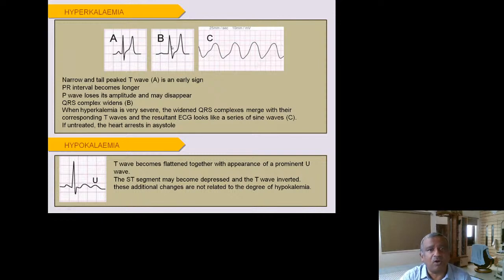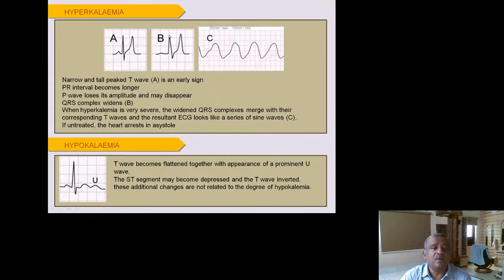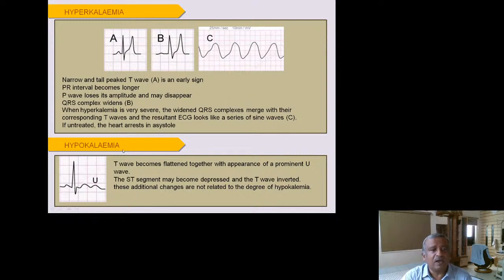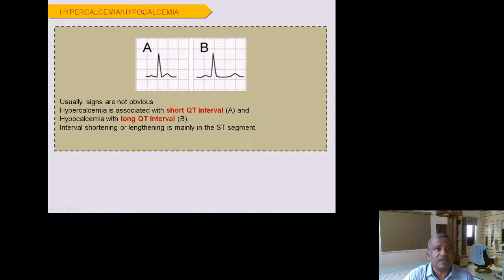Hyperkalemia produces very tall T waves that can reach the height of the R wave. Always think of hyperkalemia when you see very tall T waves, especially in a patient with chronic renal failure and high creatinine. This is a life-threatening condition that can lead to VF or VT if untreated. Hypokalemia causes flattened then inverted T waves with prominent U waves and possible ST depression. Hypercalcemia produces a short QT interval; hypocalcemia produces a long QT interval — an inverse relationship.